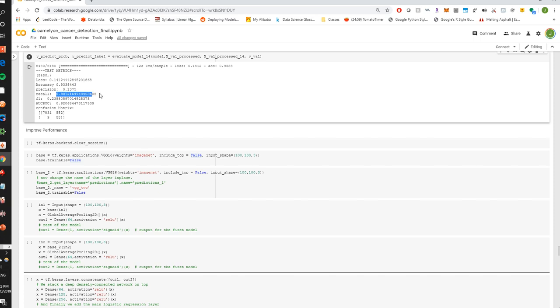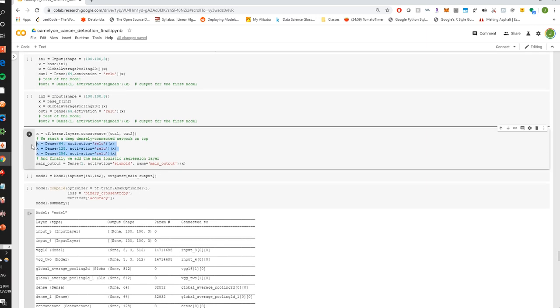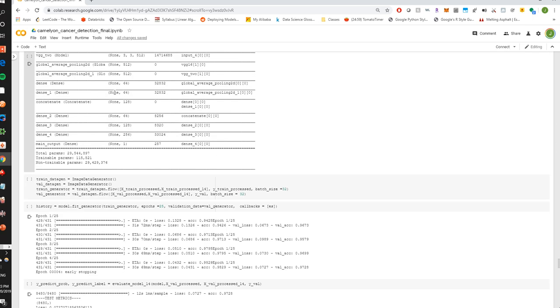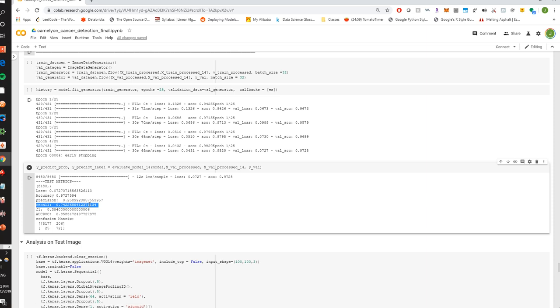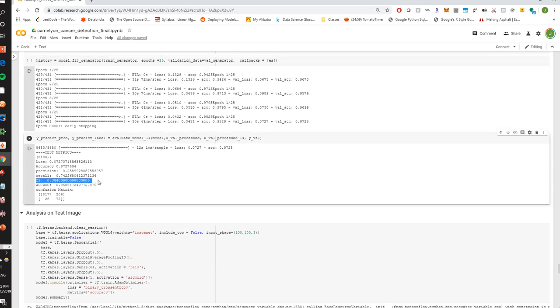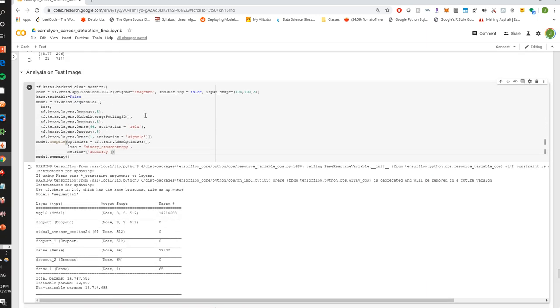That made me think that it is not learning enough about the details of these patches. So I dropped all those dropout layers and created an additional, bigger architecture by having more dense layers. And it ends up doing exactly what I wanted, which is to trade off some recall to get higher precision, and our F1 score goes all the way up to 38% with those changes. Unfortunately, it still does not outperform our first model, but it points us in a direction of what we need to do to improve this model. So that's at least an interesting thought exercise.